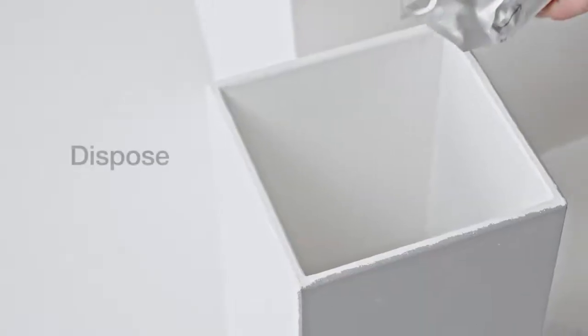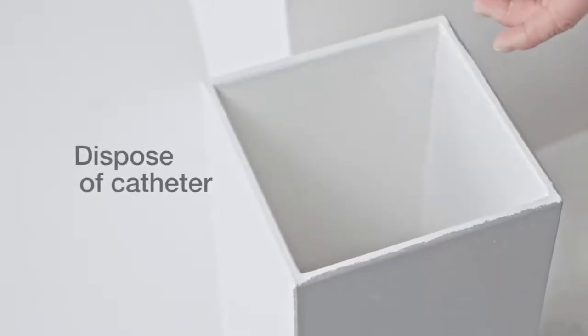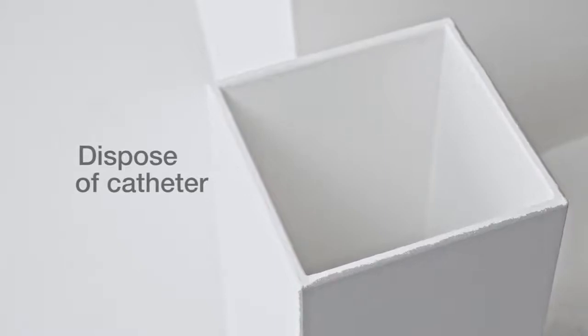Now simply dispose of the catheter and packaging in a disposal bin. Please do not flush down the toilet.